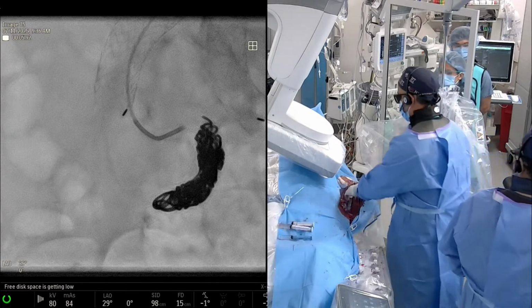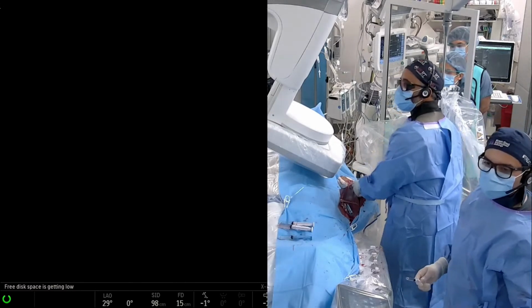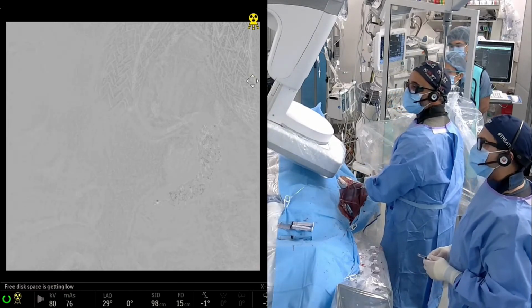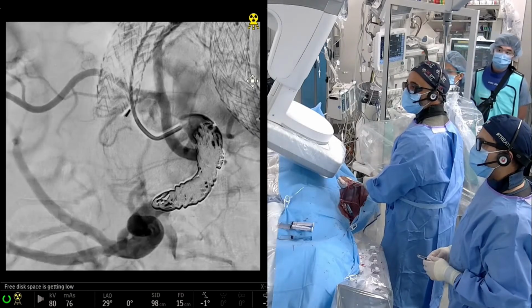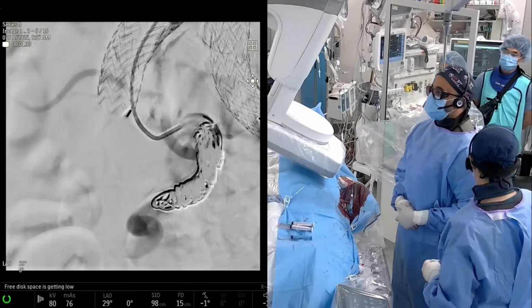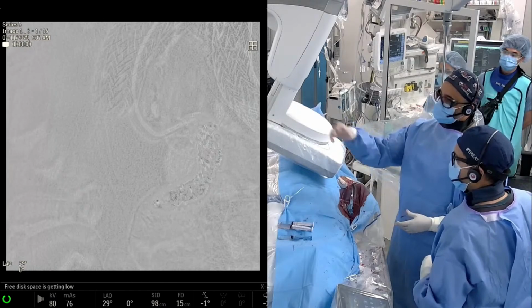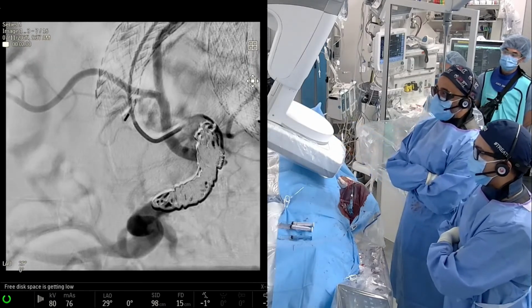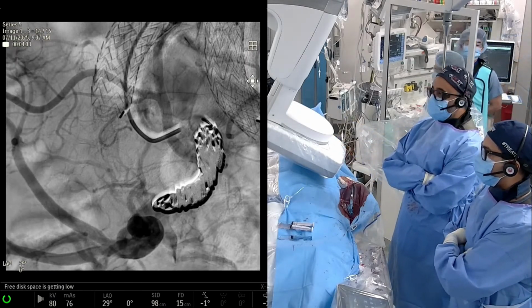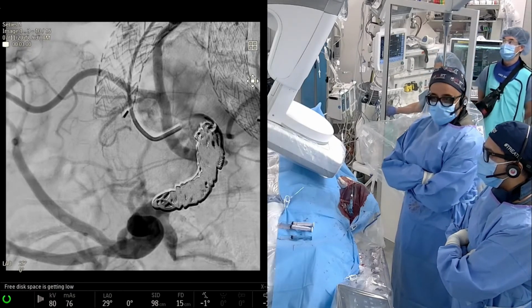Maybe we can just get a regular 035 packing, another 035 packing here, right? Yeah, I bet you do. Look at the brand. It's going to be tight, right? Yeah, some of it is that the top little part of the coil pack isn't really packing anything, because it's just sort of floating in the breeze.